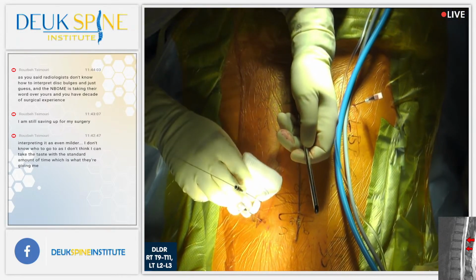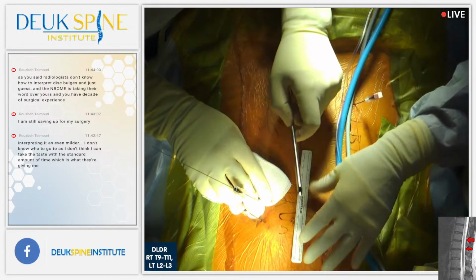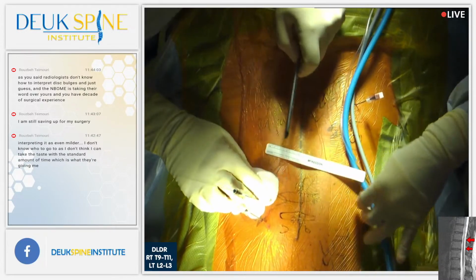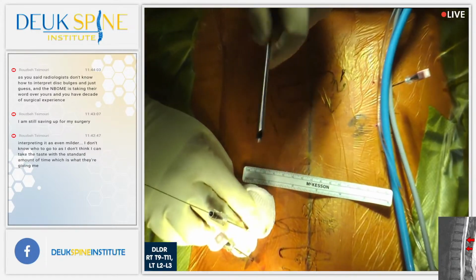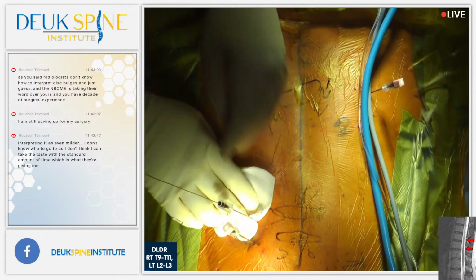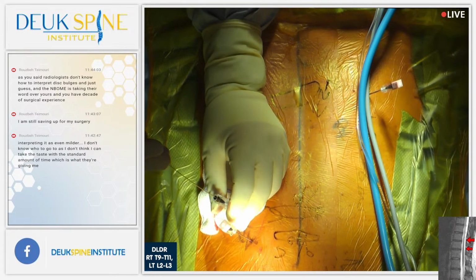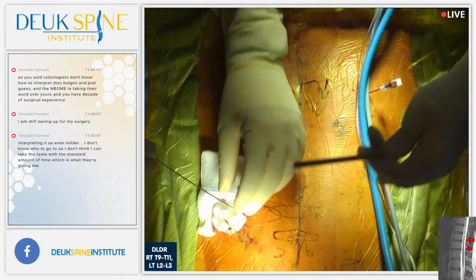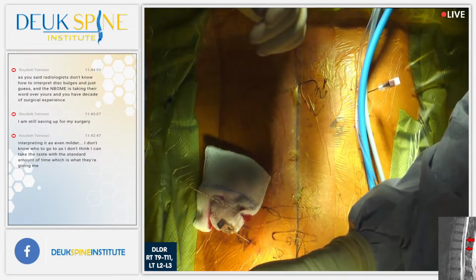Tape measure. Check this out. Put it down here. Sideways. All right, you guys see this? Look at this thing. 7mm. Okay? So the hole we make in the skin only needs to be 7mm wide. Shot. We're going to start with the thoracic, number T10-11. Shot. Guide wires in, needles out.